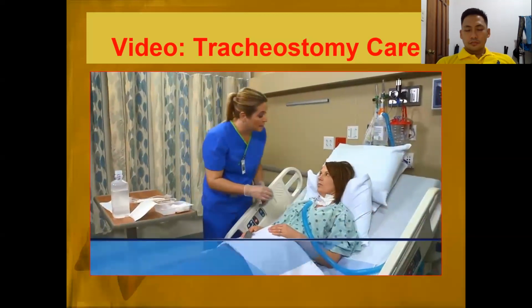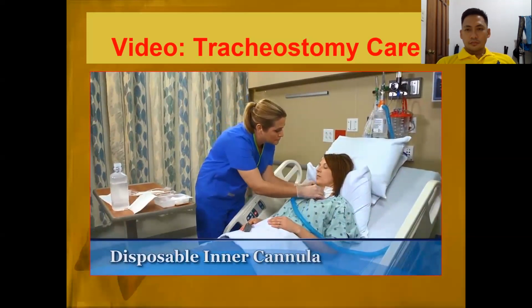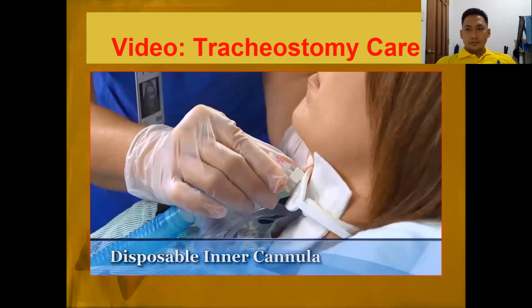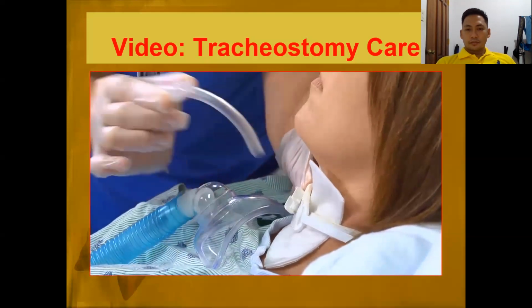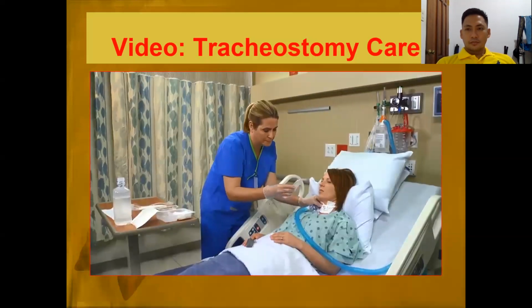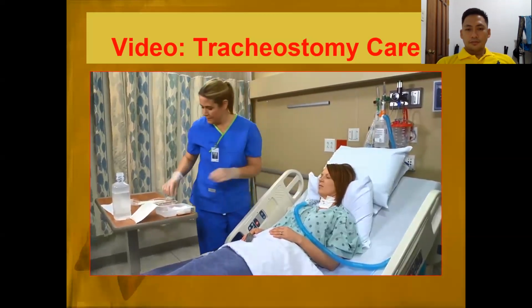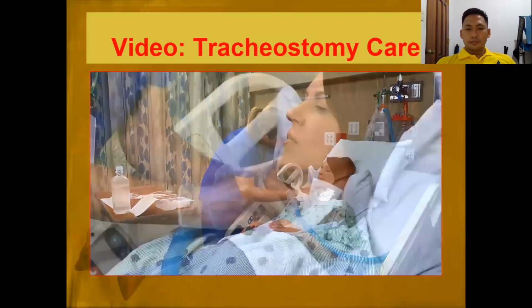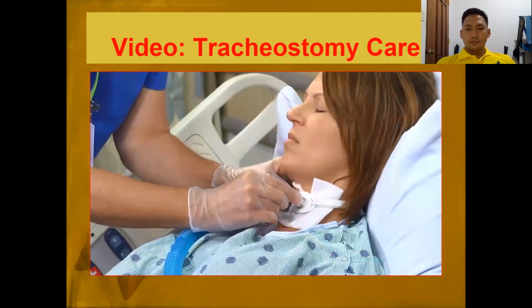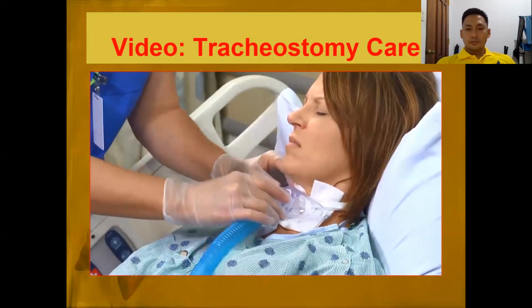I'm going to go ahead and take out your inner cannula. To care for a patient whose tracheostomy has a disposable inner cannula, withdraw the used inner cannula, touching it only on the outside. Quickly inspect the cannula for secretions and dispose of it. Then place the new inner cannula and lock it into position. If necessary, reconnect the patient to the ventilator or other oxygen source.